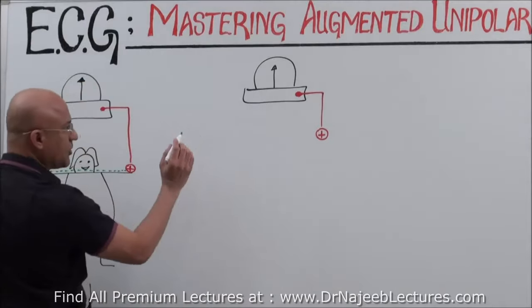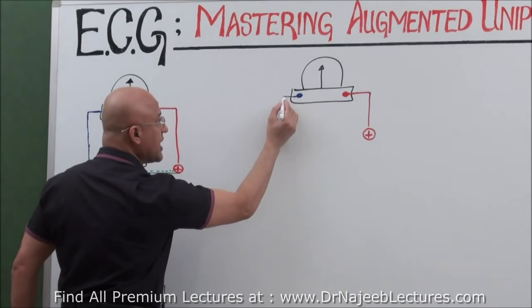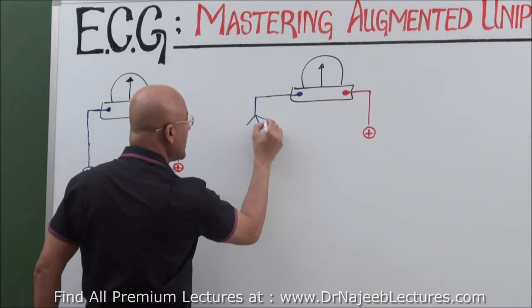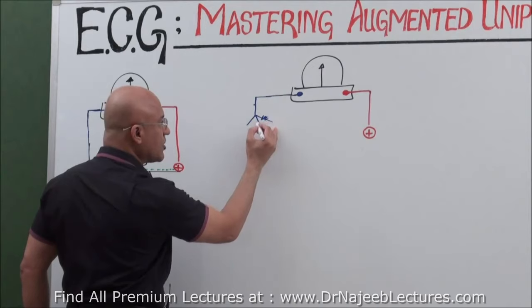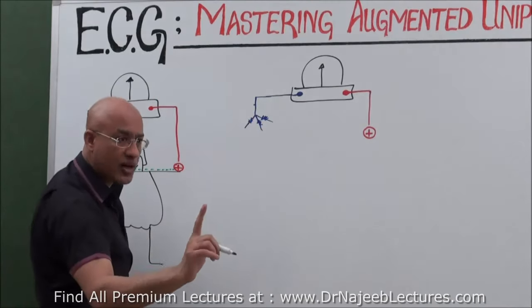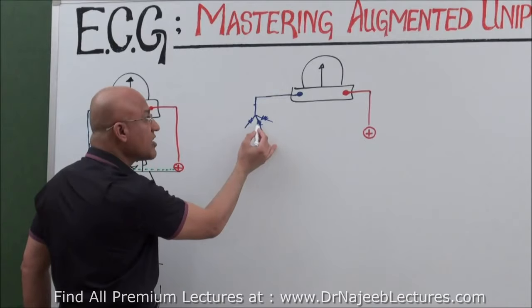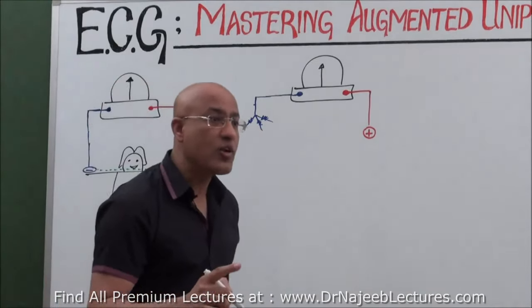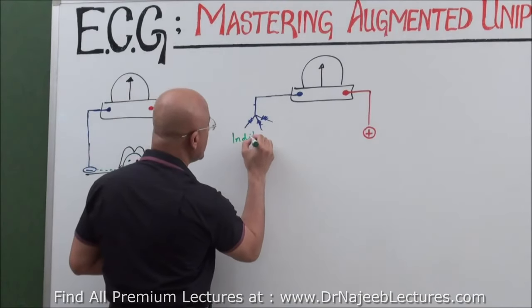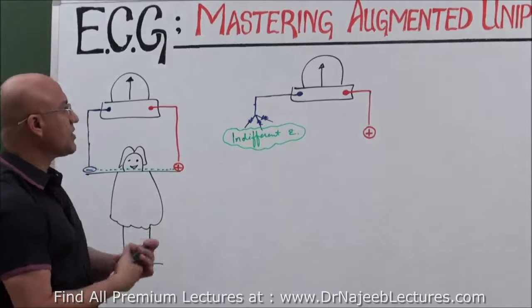But here is the difference: the negative terminal in the unipolar lead has been modified by multiple connections and through heavy resistance, about 5000 ohm. Again, in unipolar leads, the negative terminal, through multiple connections and resistances, is converted into an indifferent electrode. Negative is converted into what kind of electrode? Indifferent electrode. So what is an indifferent electrode?